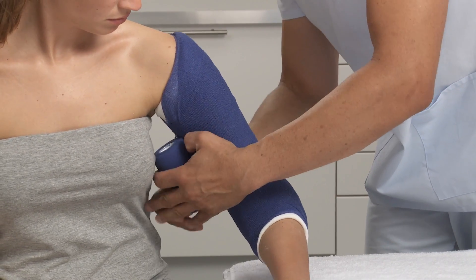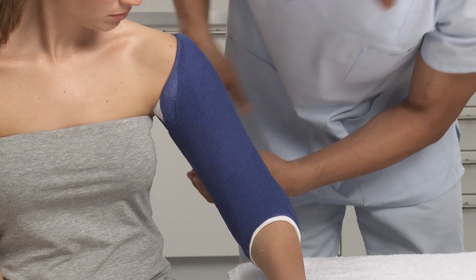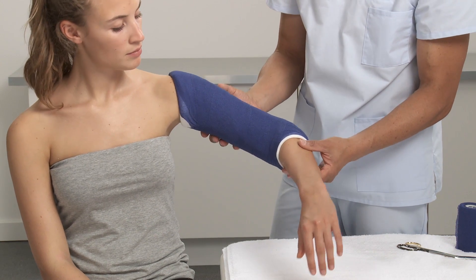Check the desired range of motion and any points that may cause irritation or pressure. After approximately 3-5 minutes, the splint is set and the patient can be released. After 24 hours, the splint is fully set.